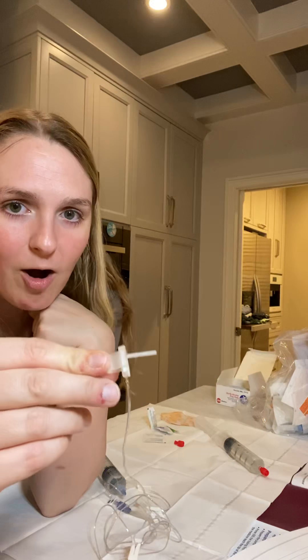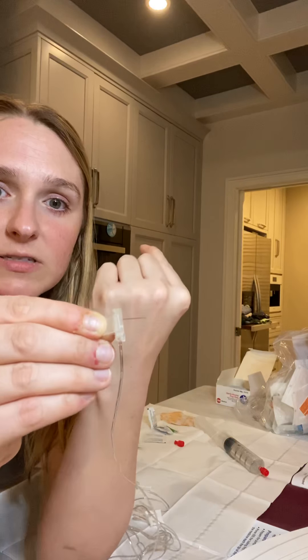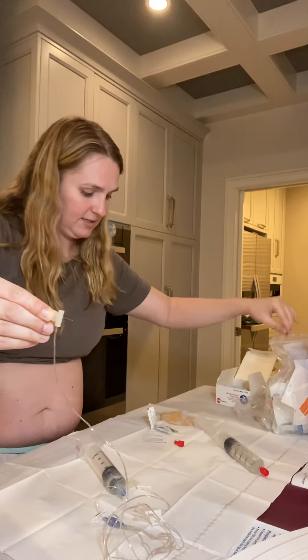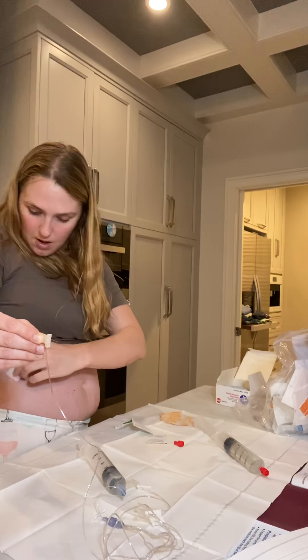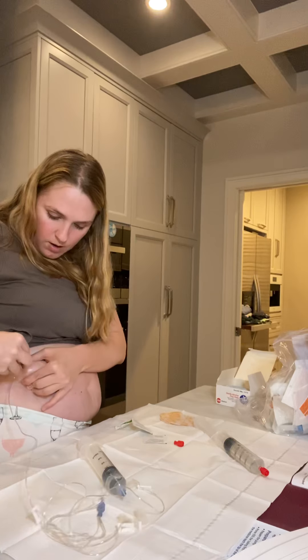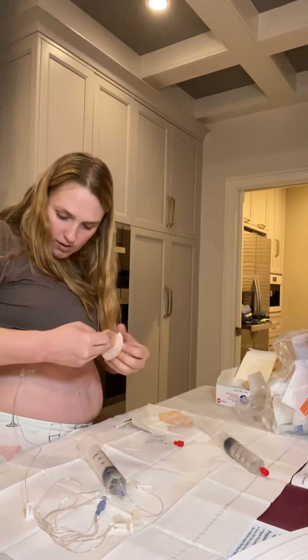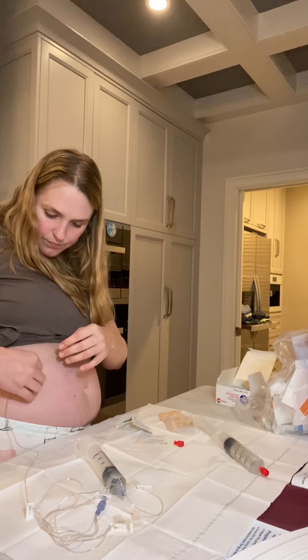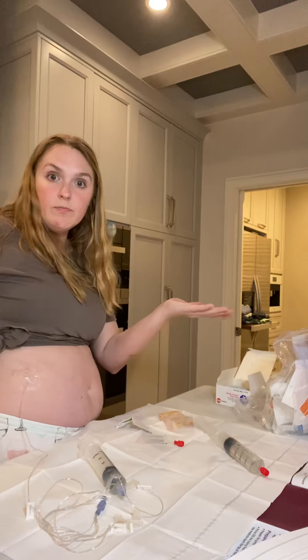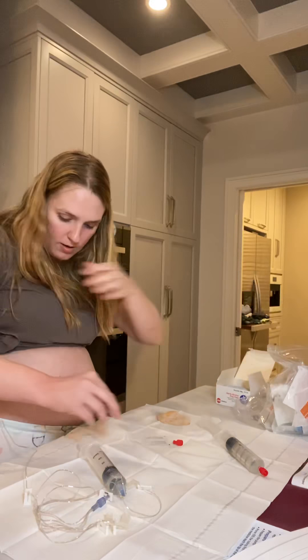This is what a lot of people want to know — how big is the needle? The needle is actually smaller than what you're seeing here. It's a really small needle. It's not fun to stick a needle into yourself, but it really is pretty small. What you do is you pinch the fat, stick it straight into the fat, and then put a piece of tape over it. From the distance of the camera you can barely even see it. Then I'm just going to do that three more times.